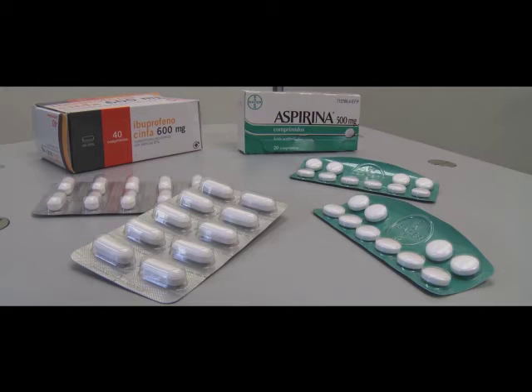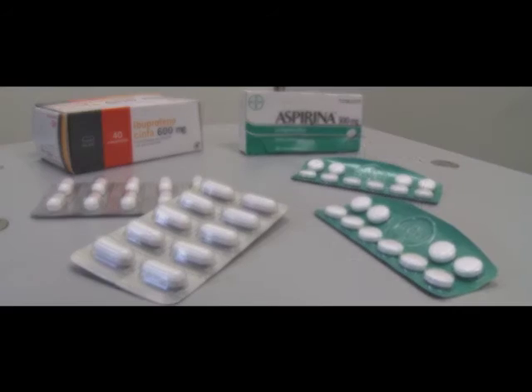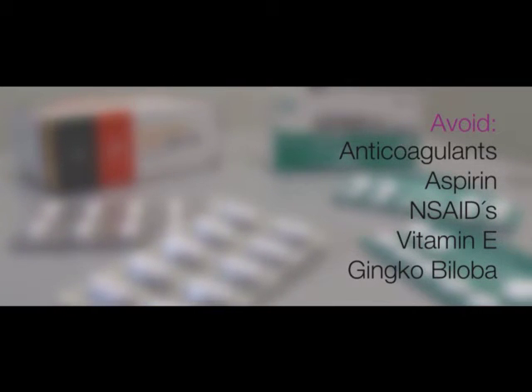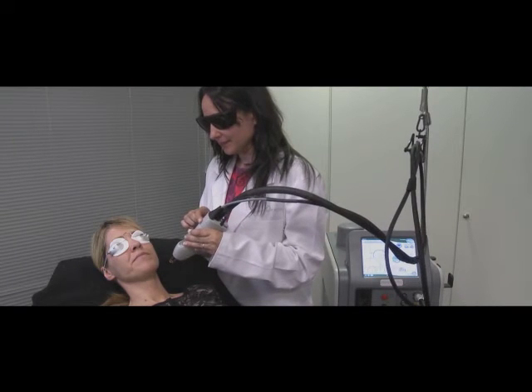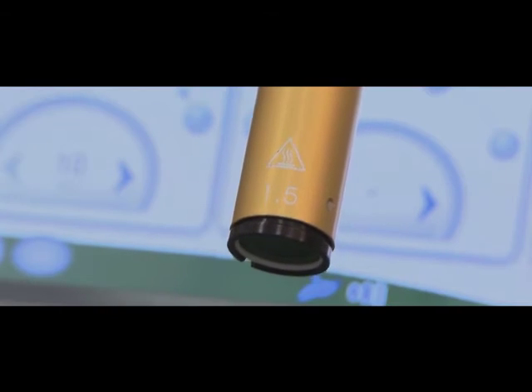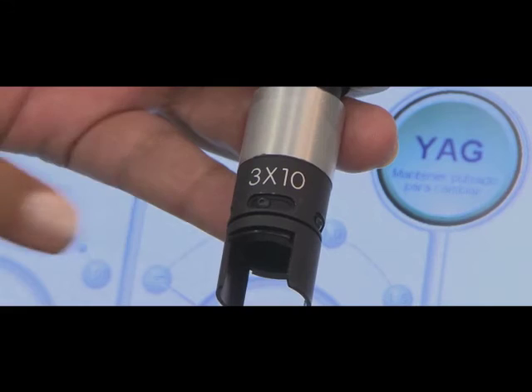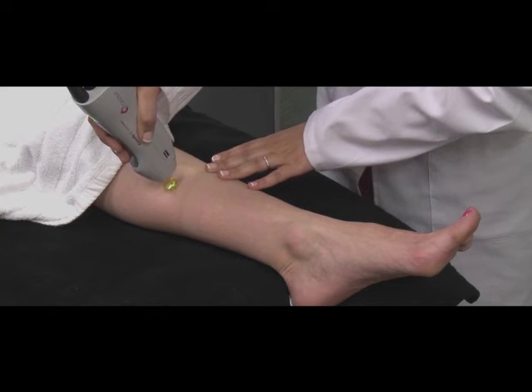Also be certain that your patients are not taking medications that will cause bleeding or bruising, such as anticoagulants, aspirin, non-steroidal anti-inflammatories, vitamin E, or ginkgo biloba. Vascular treatments are done using 3 different spot sizes. 1.5 millimeters for facial and leg vessels, 3 millimeters for leg vessels, and the 3 by 10 millimeter elliptical spot for leg vessels.